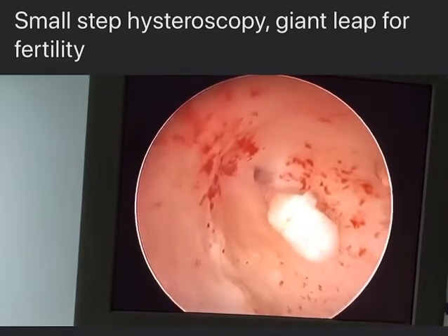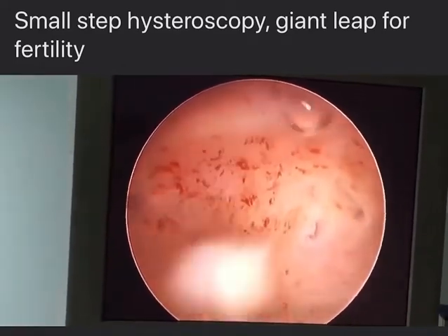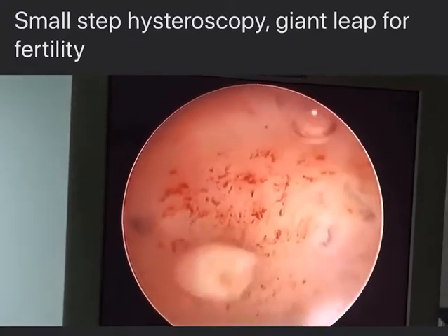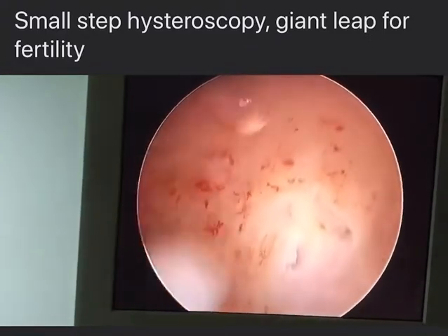All right — he is telling me to open the outflow to make it dancing. Myoma is now free and we didn't do any electrosurgery, so we have a very nice pedicle here.